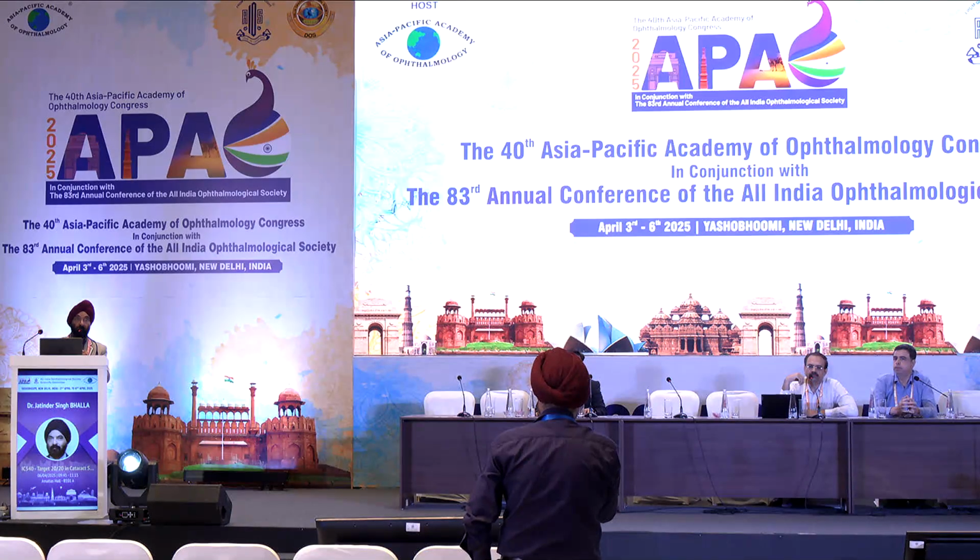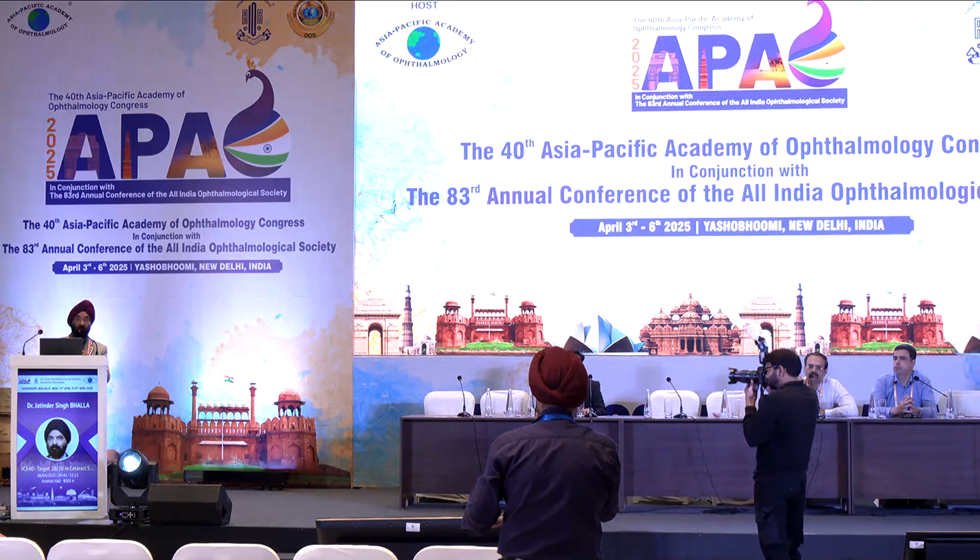We have given lubricant for 7 days. Still, it is almost similar. There is a slight change, but the readings in the IOL Master and auto K are still different by 1 or 1.2. Then I'll go with the IOL Master.